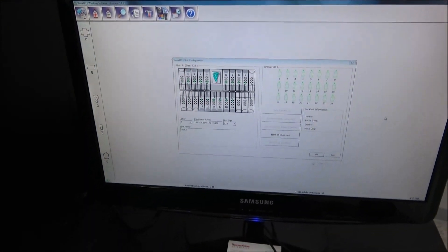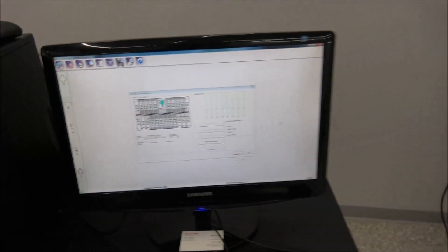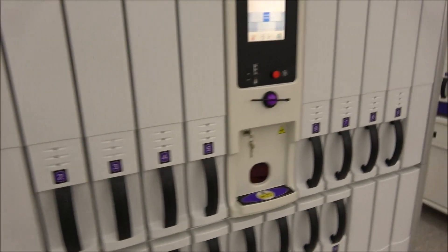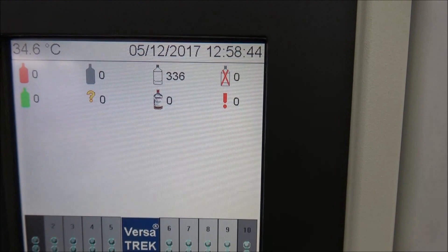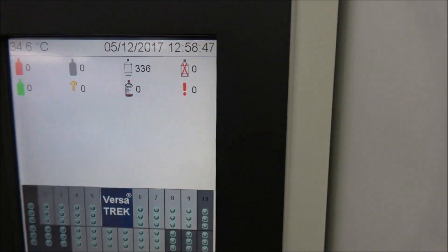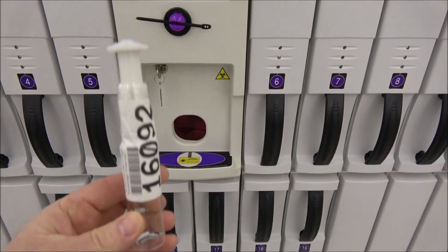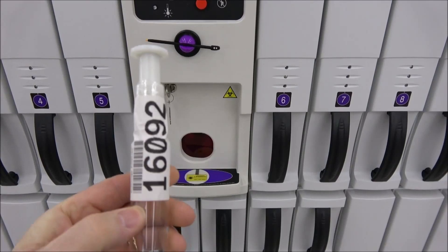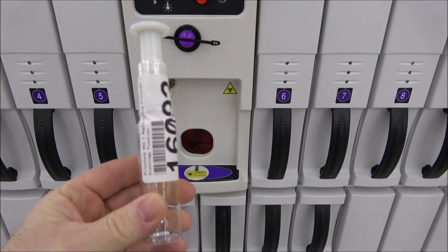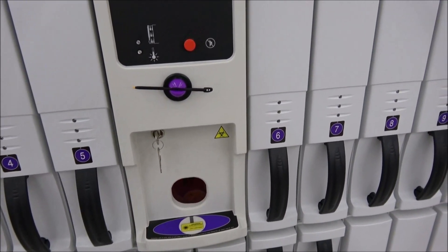The software does have a few different options that the machine itself wouldn't allow, but the machine does actually run on its own with the touchscreen interface. As you can see, it does have 336 empty slots. There's no errors. I don't have any actual bottles, but I made a makeshift bottle here — I just take a bottle to a tip. The tip is actually what is read in the drawers as you install them. I did put a barcode reader on it so we can demonstrate how this is entered and taken out.